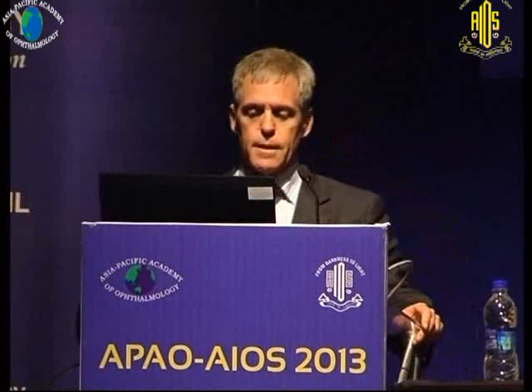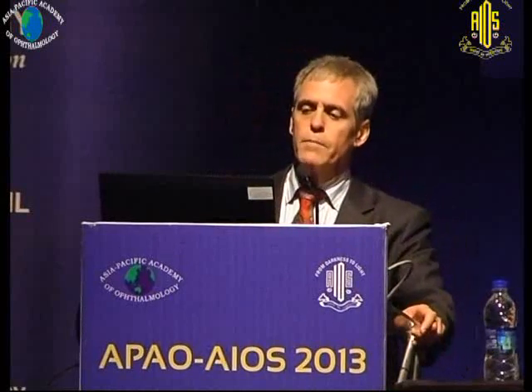Now, if you recognise that vitreous is lost, you first need to recognise that vitreous may be about to be lost or is being lost. So you may see a deep AC, poor aspiration, the pupil may alter, the nucleus may rock, and the surgeon may get a slight sinking feeling. Having recognised that the vitreous has prolapsed, you want to stabilise the situation.